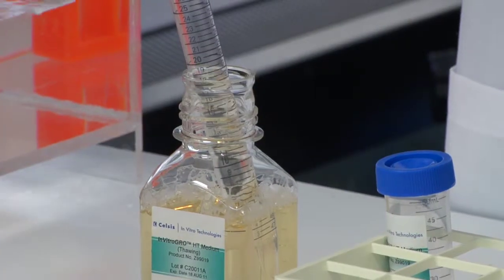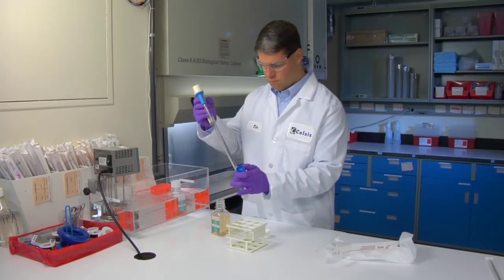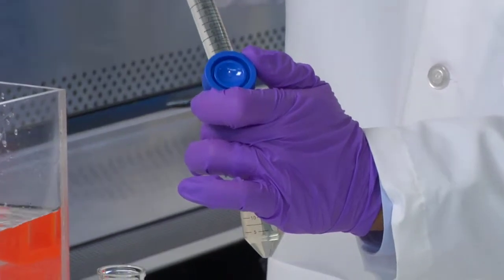Using a serological pipette, transfer 48 milliliters of the in vitro grow HT medium to a sterile 50 milliliter conical tube and place it in the 37 degrees Celsius water bath.